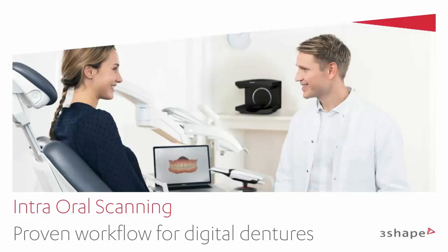I also scanned myself recently, 75 seconds on a full arch on a real clinical patient. So this is reality. The question, of course, is what about the functional impression? What about potential border molding? How does this work?